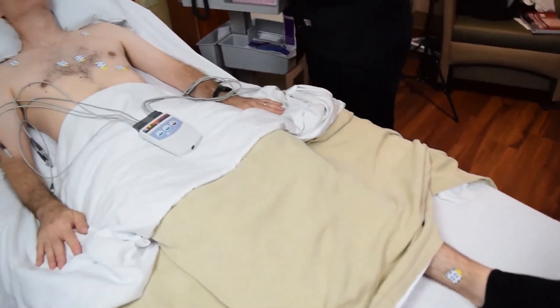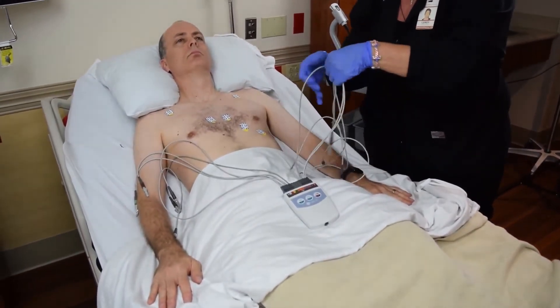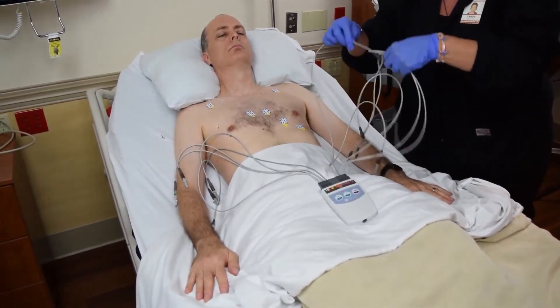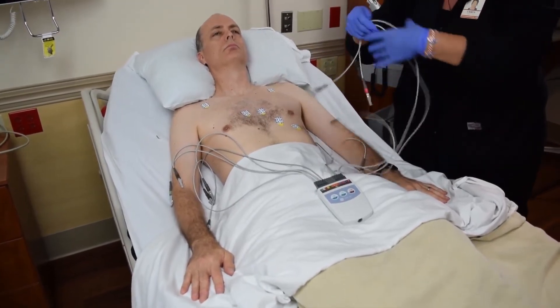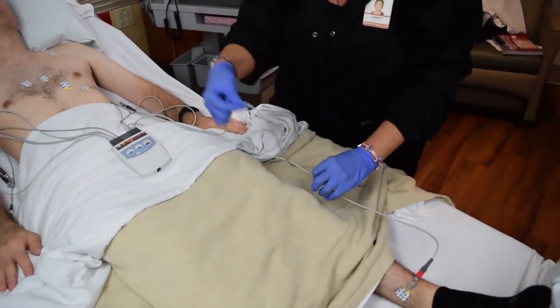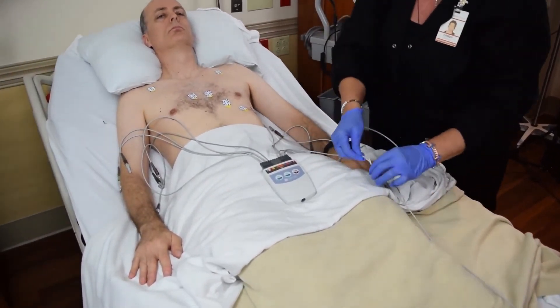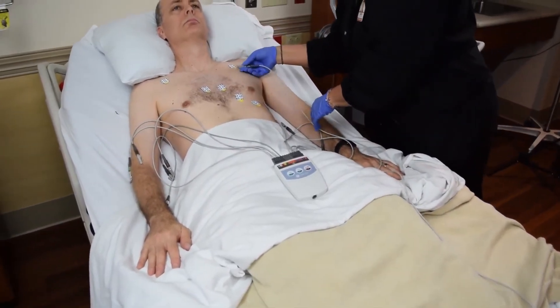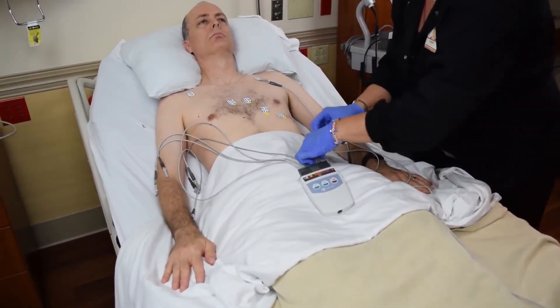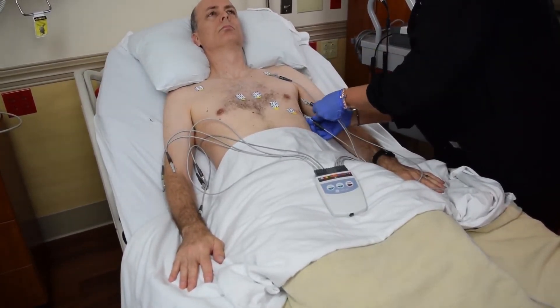Next, you will connect all of your leads. It is imperative that you follow the guide in placing the correct lead on the correct electrode, making sure that the left leads are placed on the patient's left side, and the right arm and right leg leads are placed on the right side of the patient.